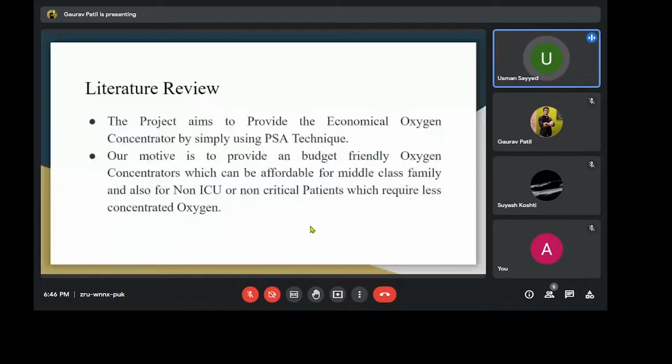You need to get your doctor's okay before you buy or use any oxygen concentrator. Using one without their guidance or prescription can be dangerous. If your doctor thinks a concentrator might be right for you, they'll let you know how much oxygen to take and how long to use this device.